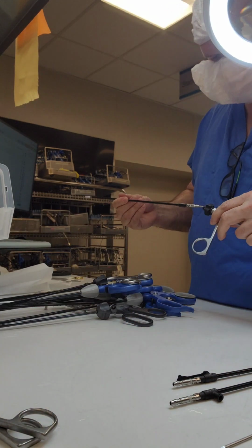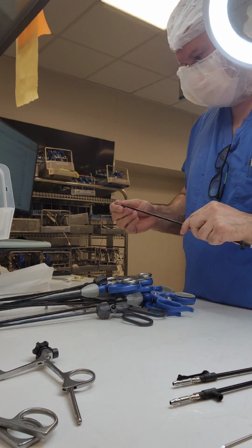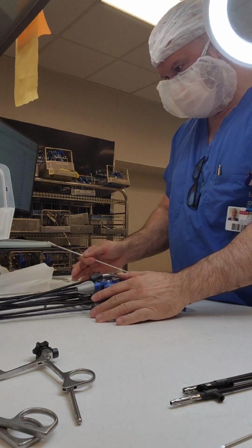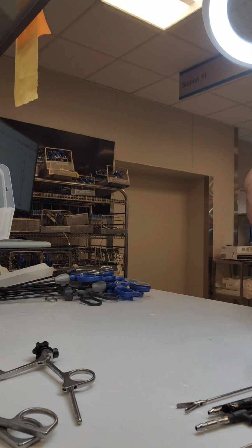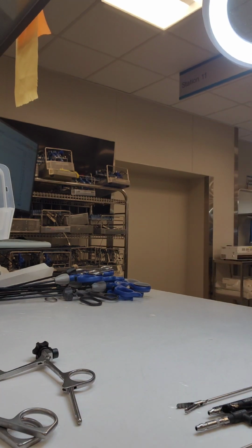What's the point of me doing laparoscopic instruments, making sure that they're clean, making sure that the insulation test passes, if when I try to assemble it, it doesn't work? You have to do the function test. I see so many people skip this step. To me, it's kind of crazy.